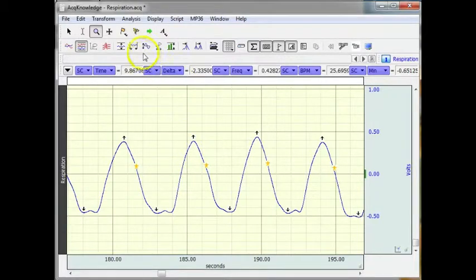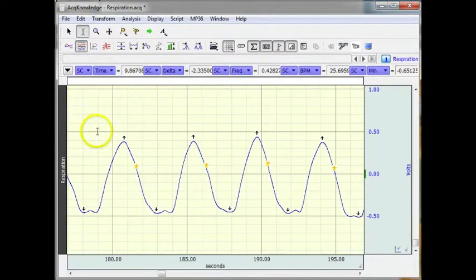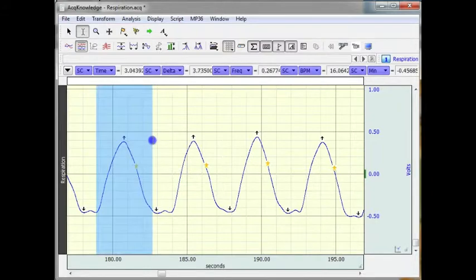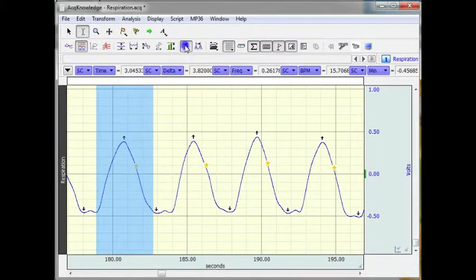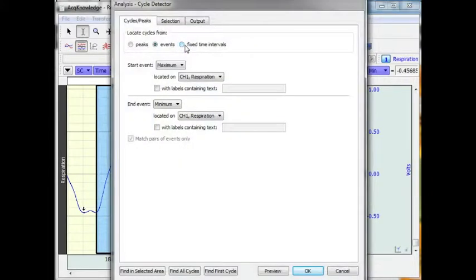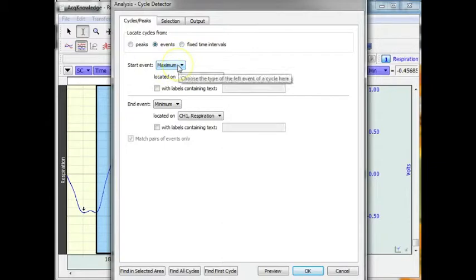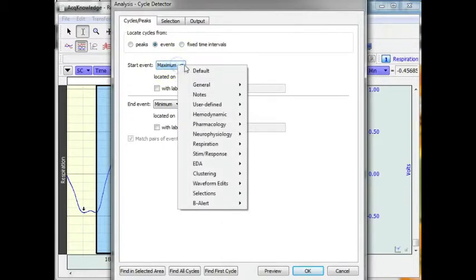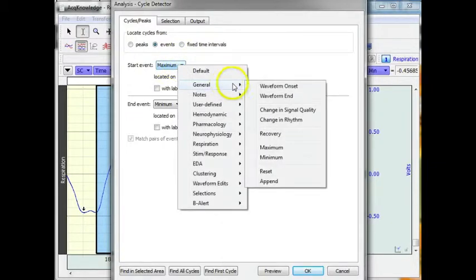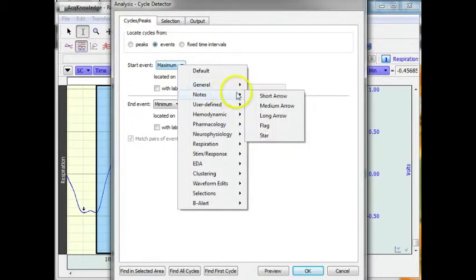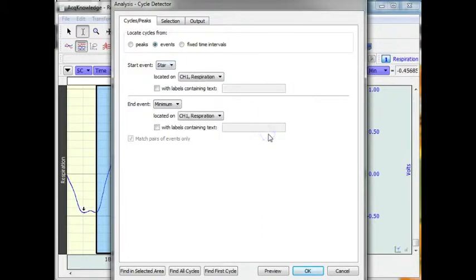Now we can take this a step further. I am going to highlight an area. Come back in. I am going to look for an event. I am looking for a star.